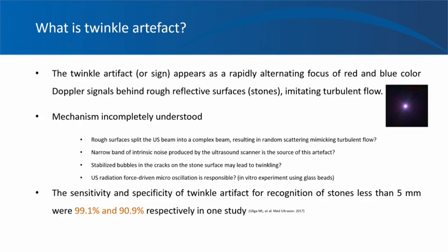So what is a twinkling artifact? Rough reflective surfaces such as stones and calcifications emit a turbulent flow signal on color Doppler and appear as rapidly alternating foci of red and blue color signals — something like a twinkling star. This is called the twinkling sign or twinkling artifact and helps us identify stones in Doppler mode. The mechanism is incompletely understood, but it could be that rough surfaces split the ultrasound beam into a complex beam resulting in random scattering which mimics turbulent flow, or a narrow band of intrinsic noise produced by the ultrasound scanner could be the source of the artifact.